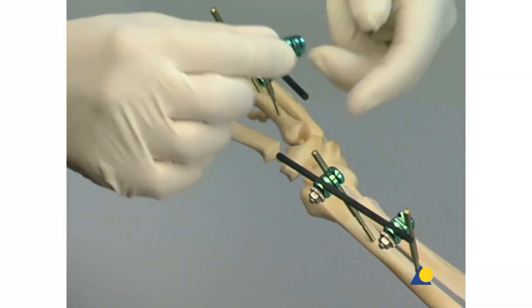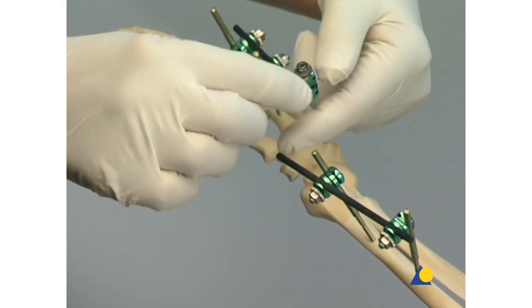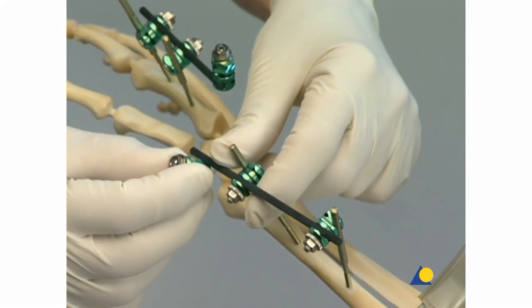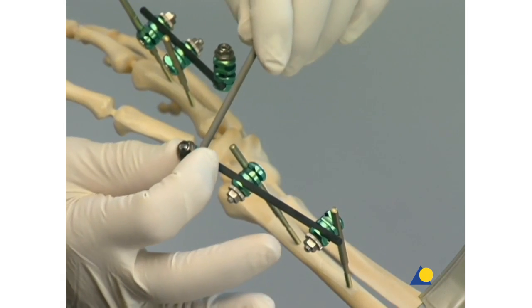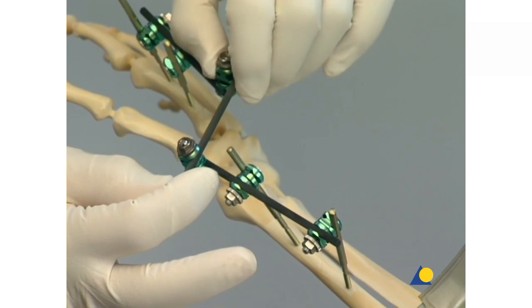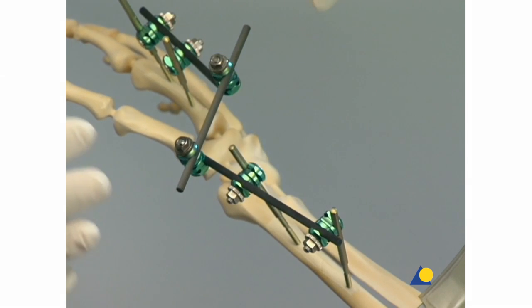The rod ends of the two fragments nearest the fracture are connected to a third rod using one clip-on self-holding combination clamp for each fragment. The nuts of the combination clamps are not yet tightened.